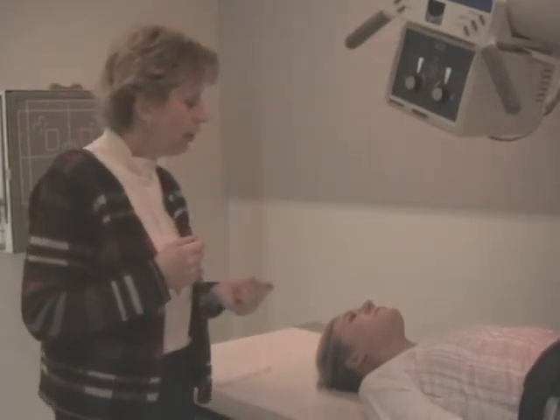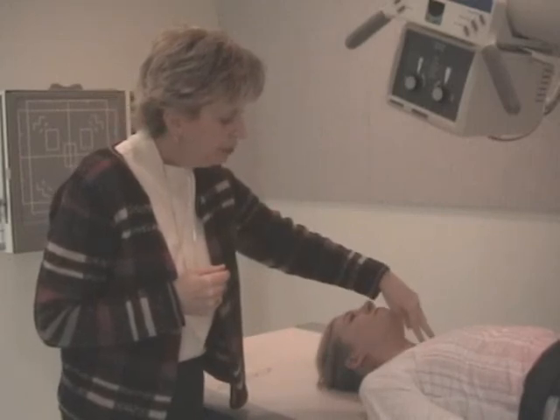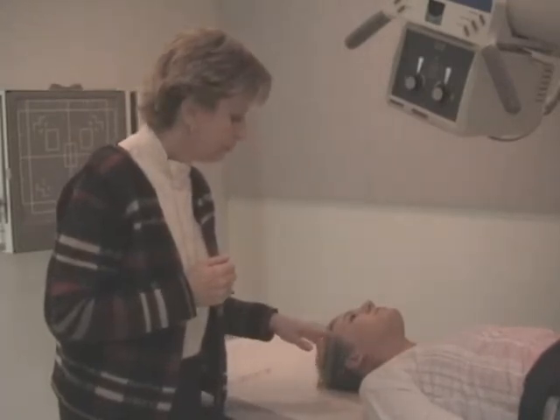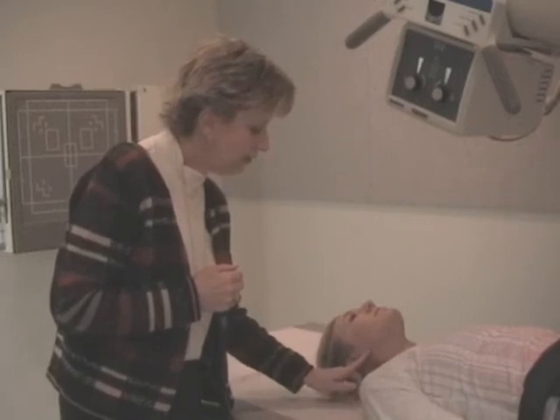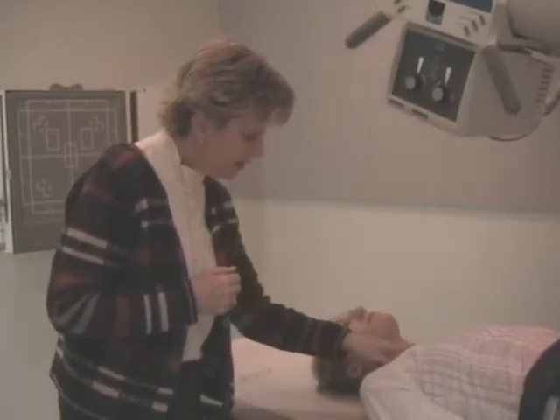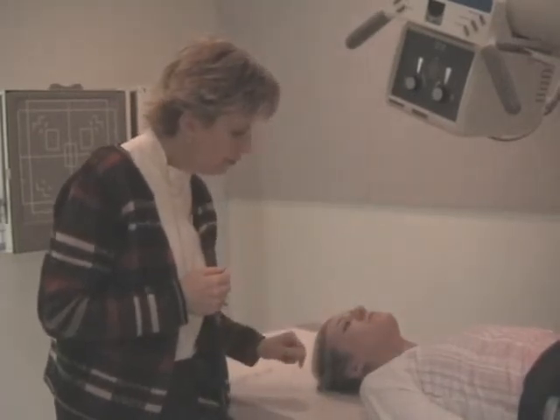If you've done a good job here, the sternoclavicular joints will be symmetrical just like they are on a PA or an AP chest. And then we're going to be talking about the angle of the mandible. The distance from the angle of the mandible to the thoracic spine is equal on both sides. If the face is turned, see how the face can turn, but her thorax didn't. So this would be an example of the sternoclavicular joints being symmetrical.